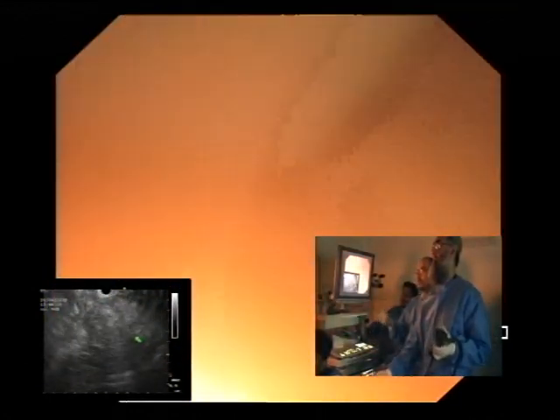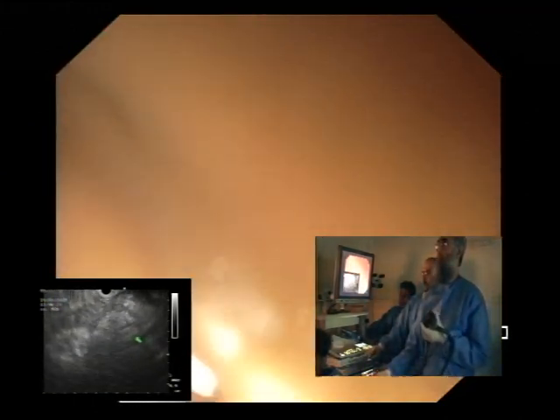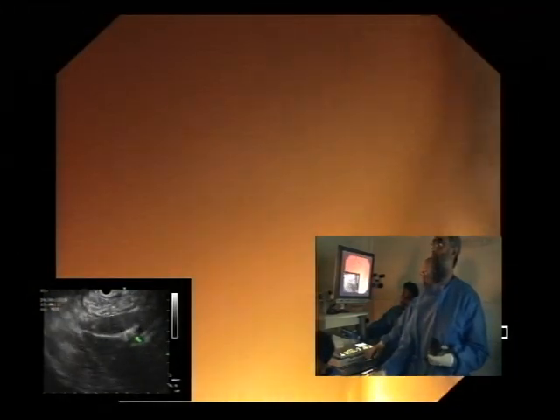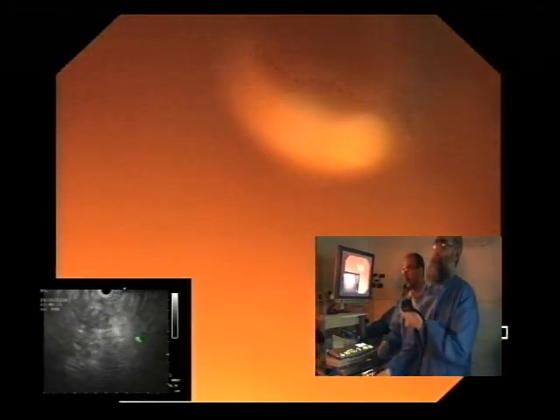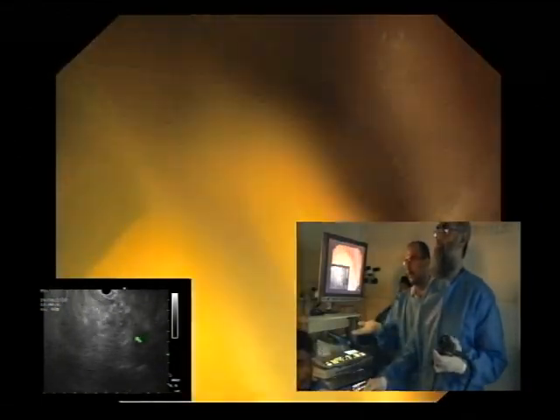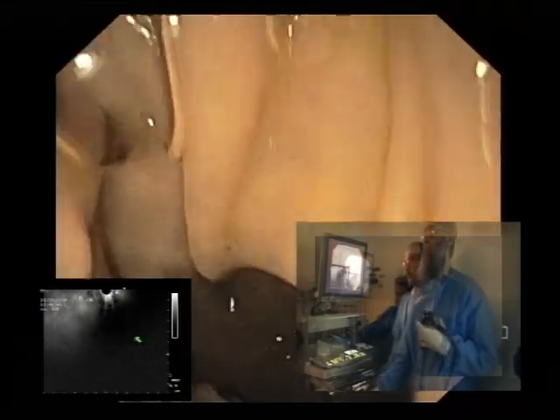Let's go to the bulb. Yeah. So again, you have to have good endoscopic visualization, so make sure you distend. And it's like ERCP that. So maybe pull back first and just distend to see where we're going. Pull back. There. Now, there you go. Now advance the scope.